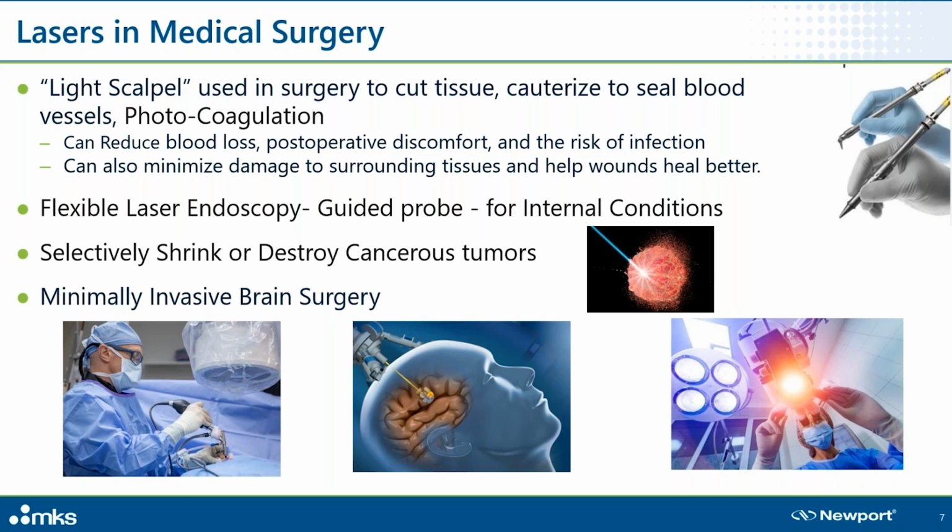Instead of a mechanical steel scalpel and a heater to stop bleeding, now with a single laser handpiece, the surgeon can rapidly switch between cutting mode and photocoagulation. These tools also have a super pulse mode that results in less tissue heating around the cut region. This helps with better healing and less scarring.